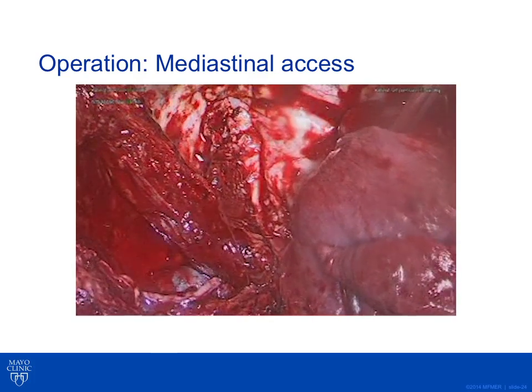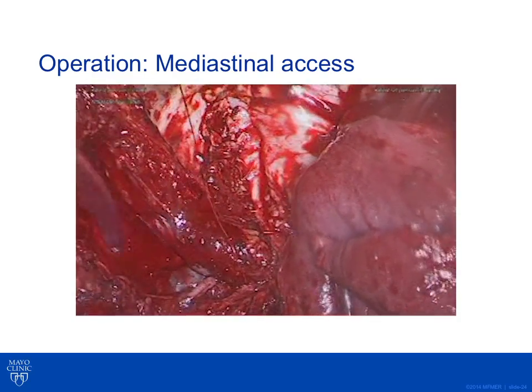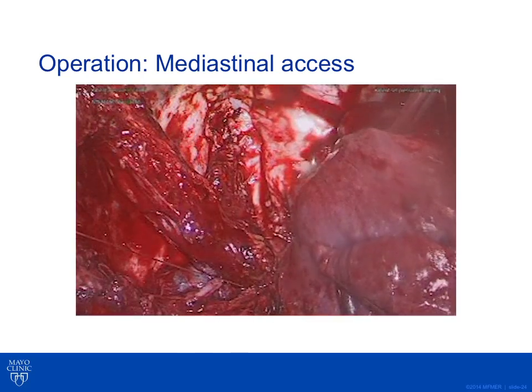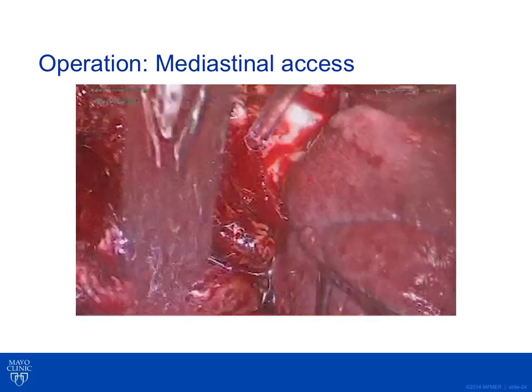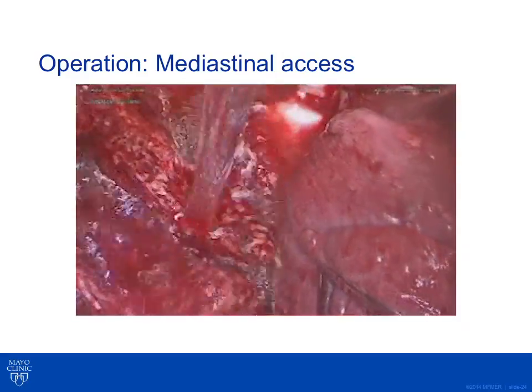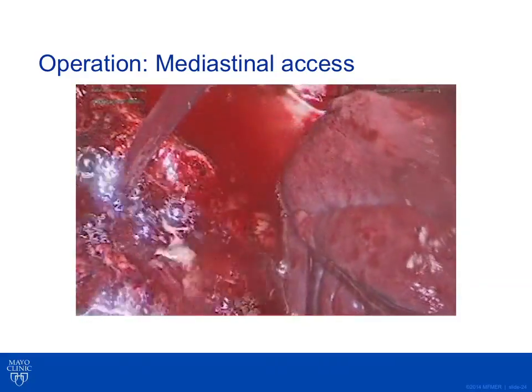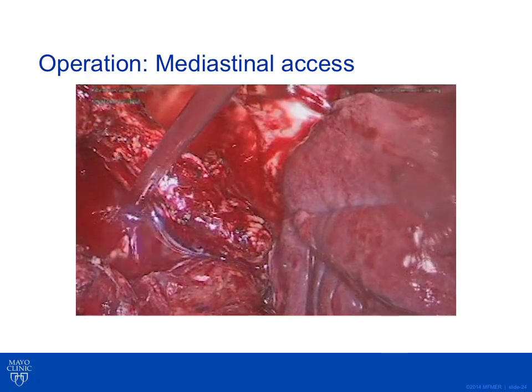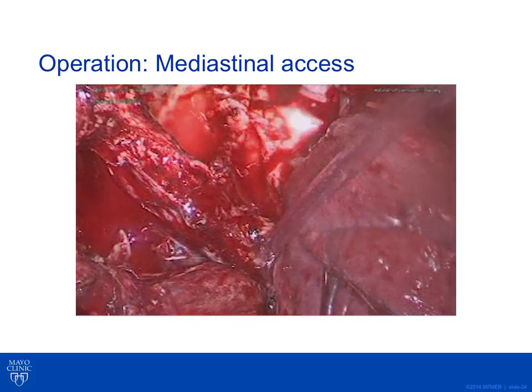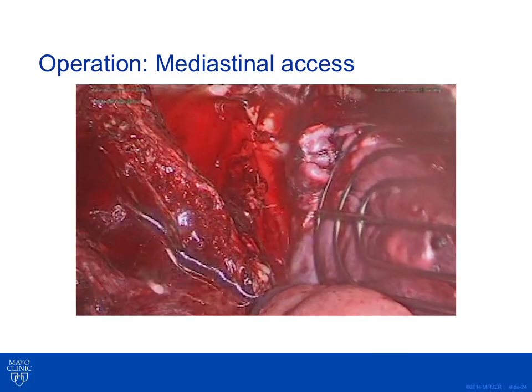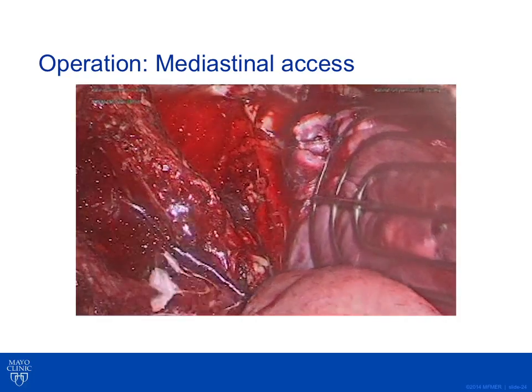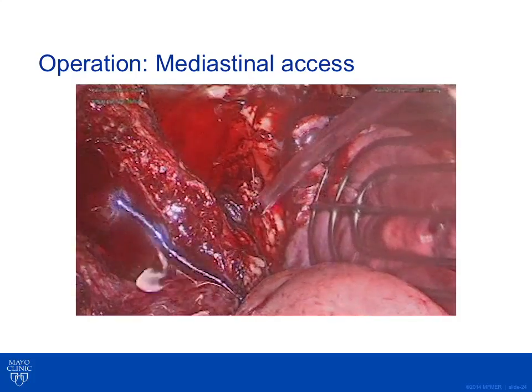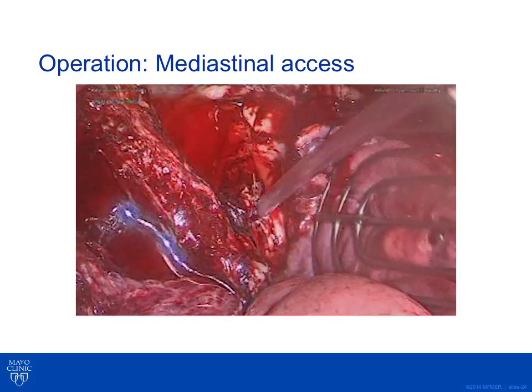The intercostal muscle used to repair the membranous trachea was cut back to a dopplerable good signal before suturing into place, ensuring we had healthy muscle repairing the trachea and would not have muscle necrosis after the repair. We then tested the repair underwater after bringing the cuff down. The retractor on the lung held back the ventilated lung, but the remaining lung can be seen coming up as evidence that air was traversing through the trachea. No air bubbles were detected.